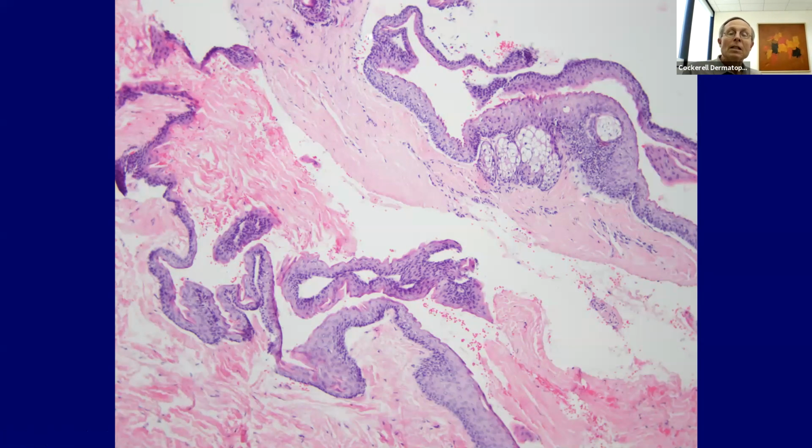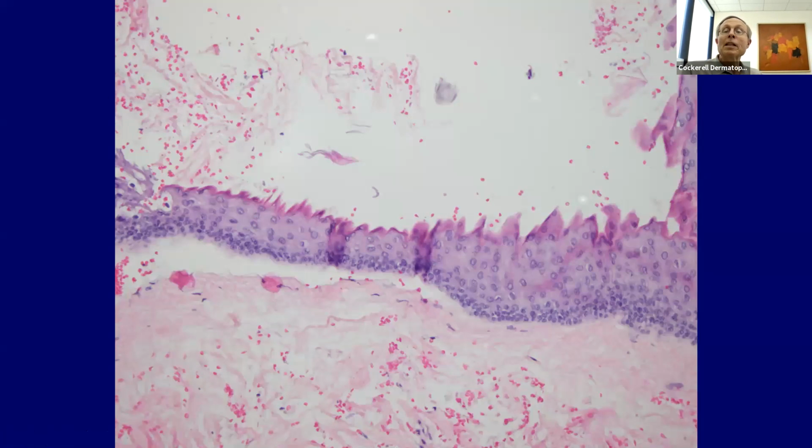I like that. So when you see that pattern, even if you don't see very many sebaceous glands, you should still think about the diagnosis. Of course, if you see the sebaceous glands, Miller time, you got the diagnosis, no problem. But if you see this alone, it's very helpful. So that's virtually pathognomonic. Somebody says, well, can you see similar lining in dermoid tumor? Yeah, not usually as much of this as in dermoid. So I don't like that.